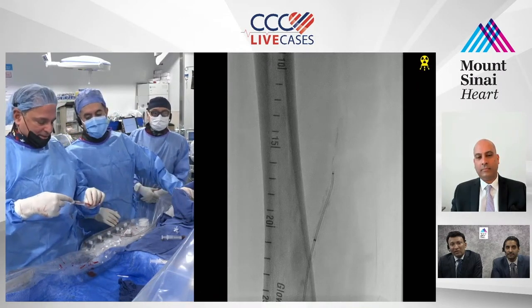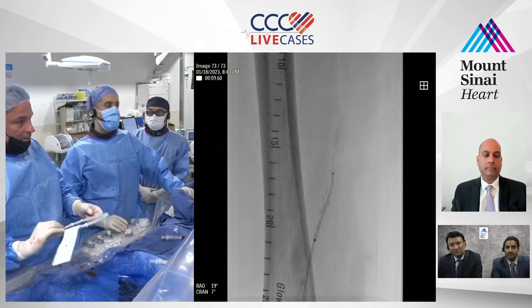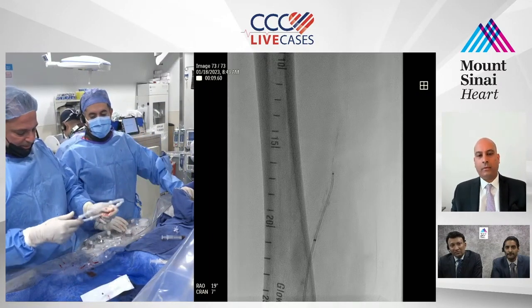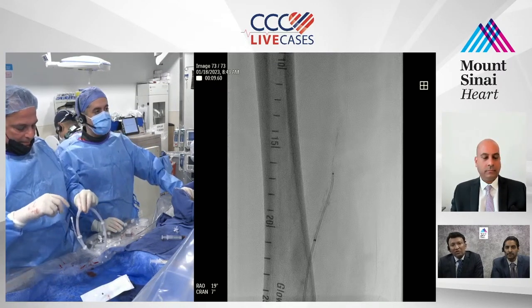Unless the plane is really big. It might be a really big plane. Okay, give us a Command 018 now. I'm glad you opened the Outback, so we can do the Outback if we need to. Let me just try with the Command. We'll know where we are. This is the old one, right? Yeah, because the 035 did make a big plane, so it could have been the plane.